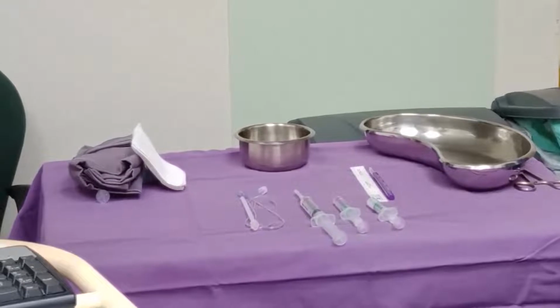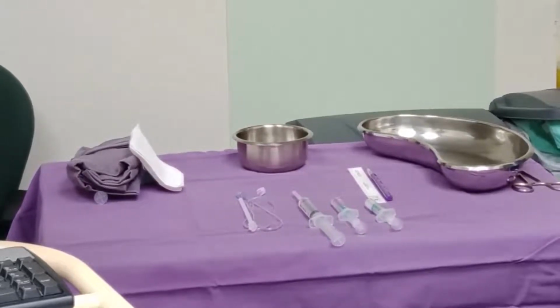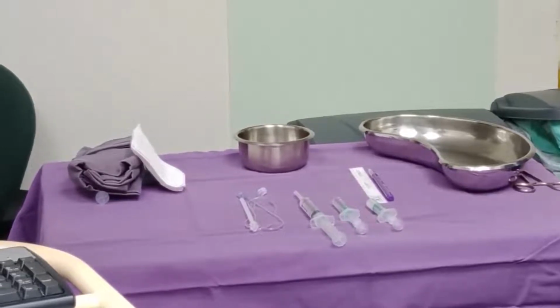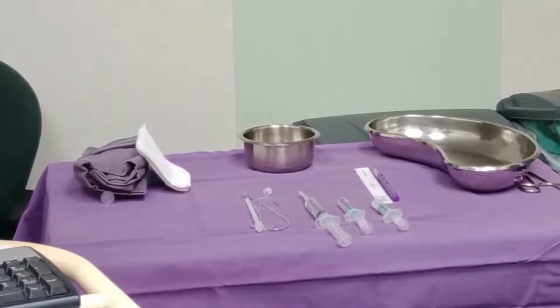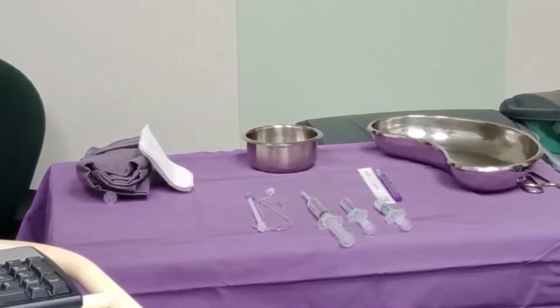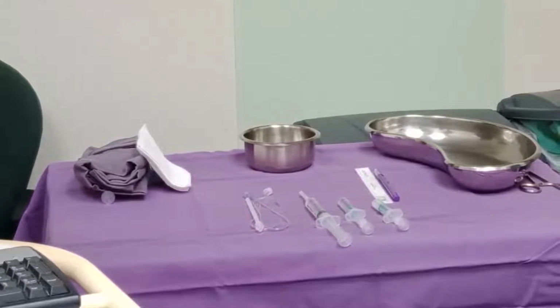In this one, we are using a 10 centimeter echogenic needle which has a blunt end to avoid penetrating injury to the nerves. Along with it is a 25 gauge needle, a 10 cc syringe containing 2% lignocaine, and a 5 cc syringe containing contrast. For the transforaminal epidural, we use 40 milligrams of triamcinolone in a 5 cc syringe.